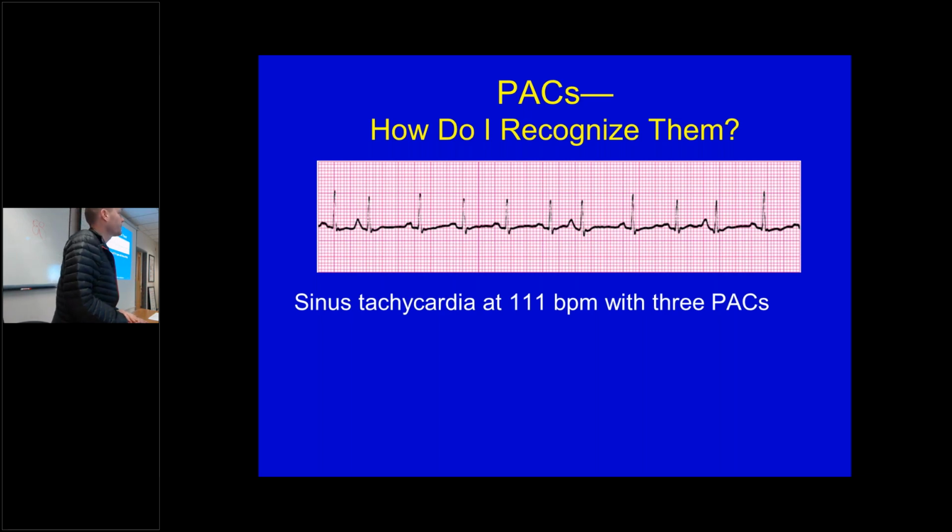I might have missed this in your talk. When they throw in the PVCs or PACs up there, I see this quite often. Why the long complex after that? What do you mean, why the long complex after that? Why the space? Yeah, where you throw in the PACs here, and then it seems longer and wider. Is this the heart resetting?